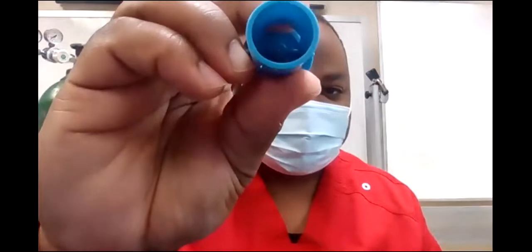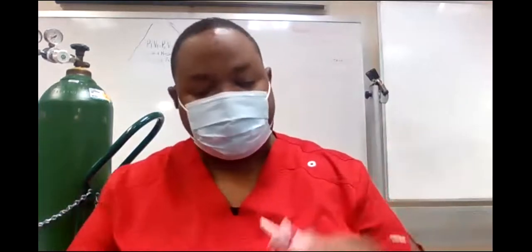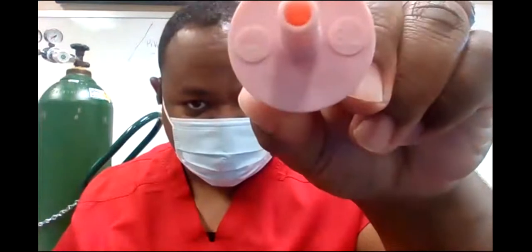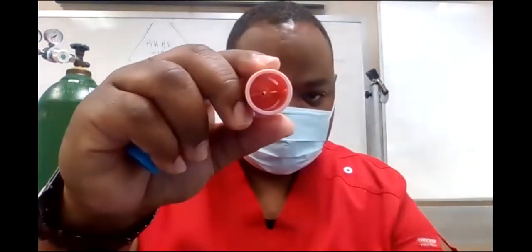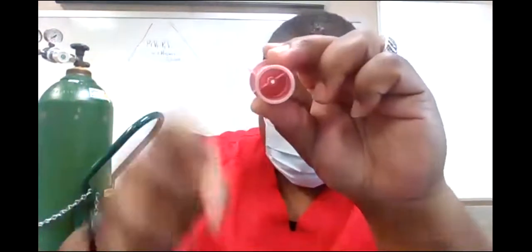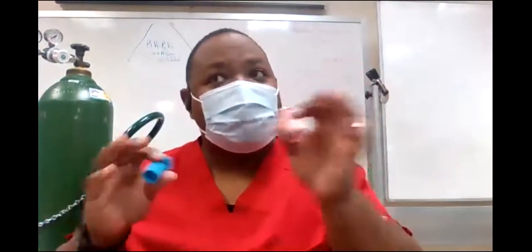And this is how it's made. You take the Venturi piece, right? Because all of them have a different orifice inside of there. See how small that hole is right there? That little bitty hole. Then if you take the pink one, which is 40% oxygen, they're always the same. Pink is 40%, okay? See if you can see the 40 on there. 40% as long as I turn it on how many liters? 8 liters. See that hole? Look how much bigger that hole is compared to that hole. So more oxygen is getting through, right? And so that's how they make their Venturi device, right?